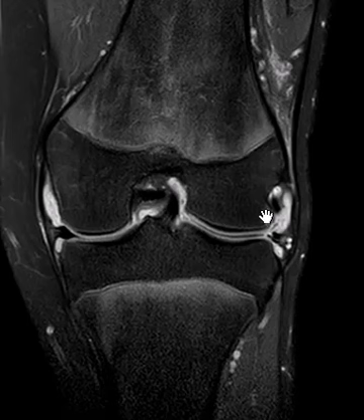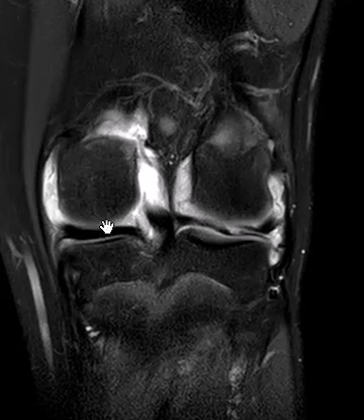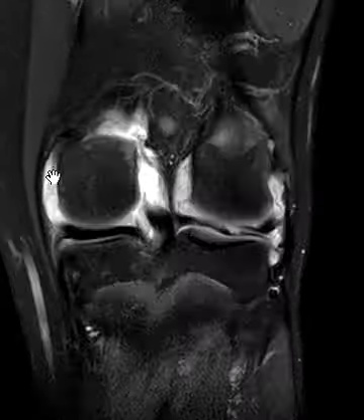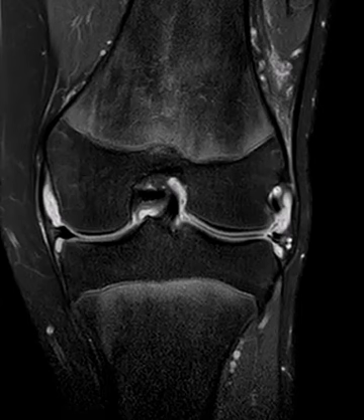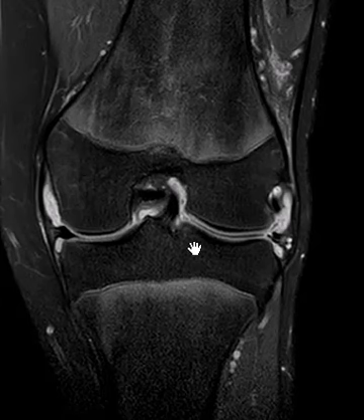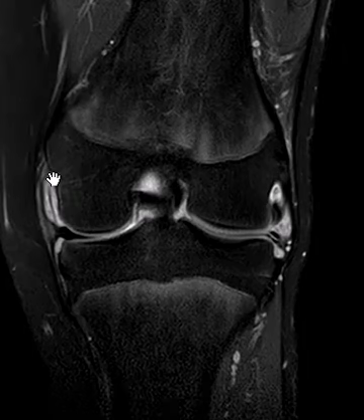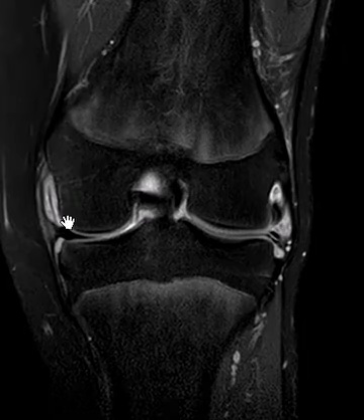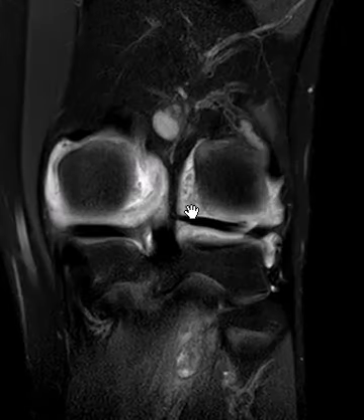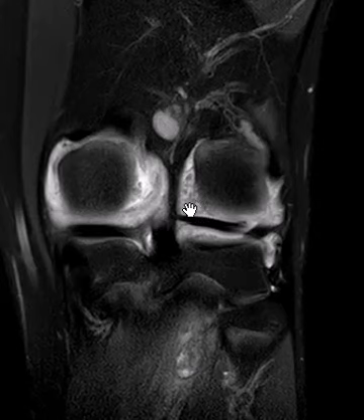This is the medial side, lateral side, and you can see the knee joint is not normal — there's bright signal, everything in here is too thick and too bright. So this is synovial inflammation and fluid — a synovial inflammatory process within the knee. It's not just fluid; it looks too gray.